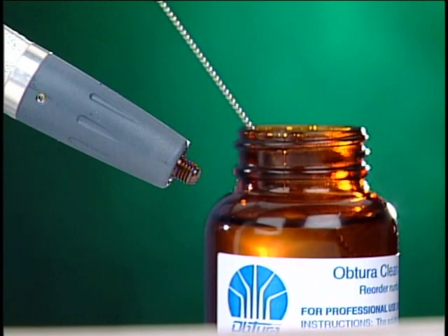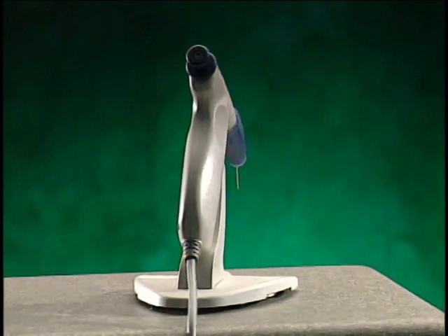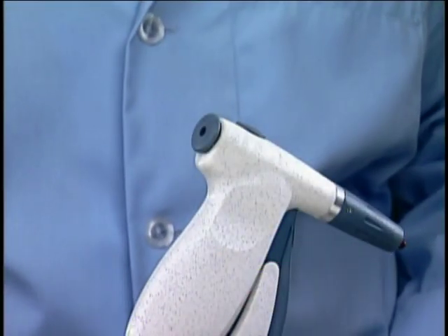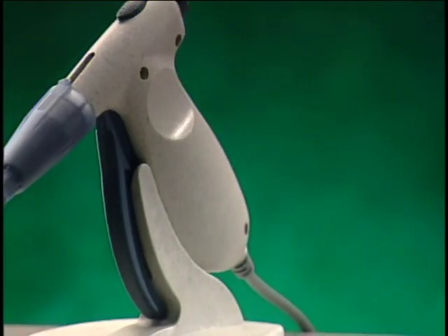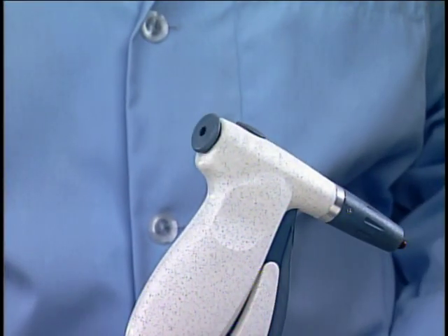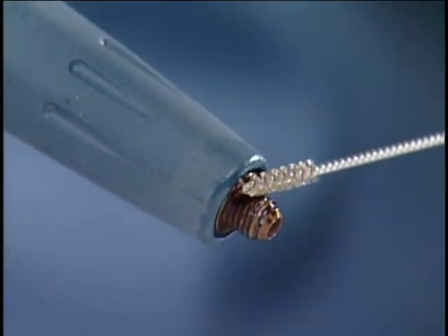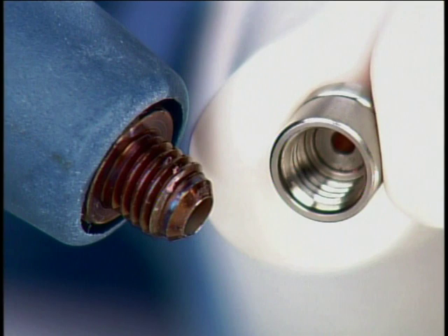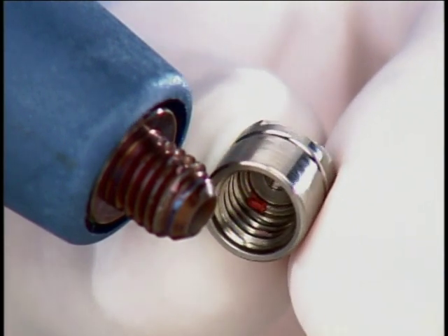Next, dip the cleaning brush in the bottle of Obtura cleaning solution. Insert the brush into the back of the Obtura handpiece through the entire length of the gun. Use a back and forth motion to completely clean the inside of the heating chamber. The blue part at the rear of the handpiece is called the handpiece bushing and can be removed if necessary: depress the plunger release button, turn the bushing counterclockwise and pull outward to remove. When reassembling after cleaning, depress the plunger release button, reinsert the bushing, and turn clockwise until it locks into place. After cleaning, remove all residual gutta percha from the threaded end of the heating chamber to provide a leak-proof seal when installing your applicator needles. Check that the needle nut is clean and free of residual gutta percha, as threads coated with gutta percha can act as a thermal barrier which may affect material flow. If necessary, clean or replace the needle nut if its threads are coated with gutta percha.